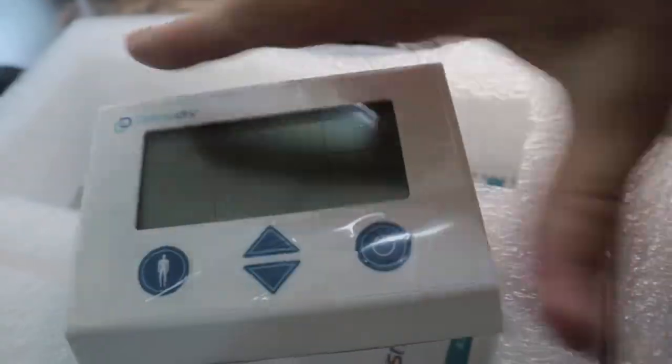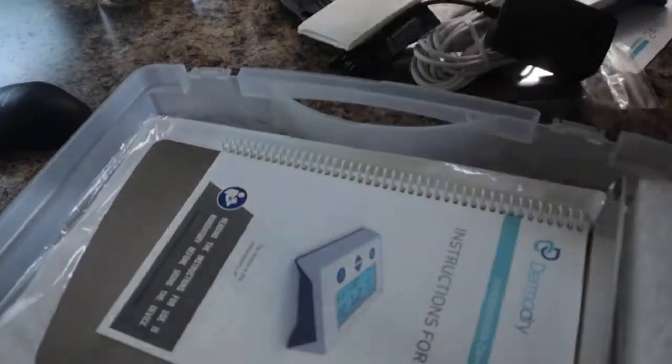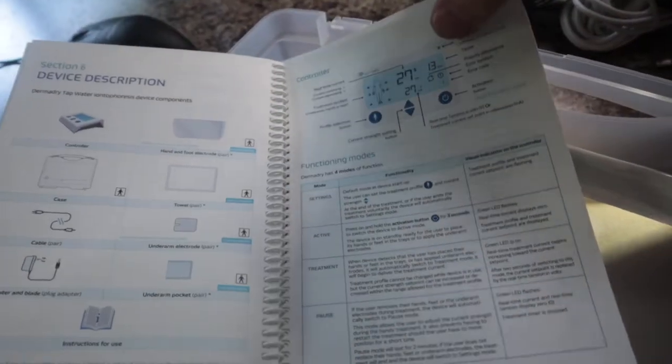This right here is the Dermadry controller. You turn it on and can pick the part of the body you want to treat. This is where all your ports go in to plug in everything. Underneath the foam here you have your instructions for use — man, this is a book right here. They give you everything: cautions, warnings, treatment schedules, device descriptions — everything you need to know about this thing. They give you the whole nine yards. Y'all can pause the video on any of these pages to read if you need to.